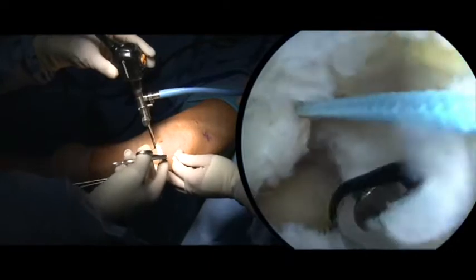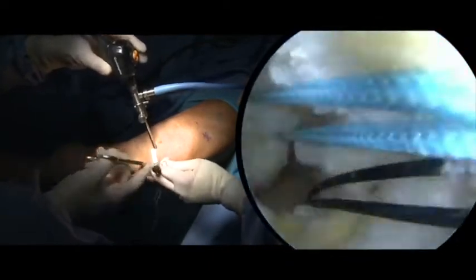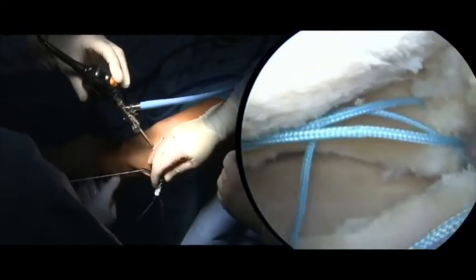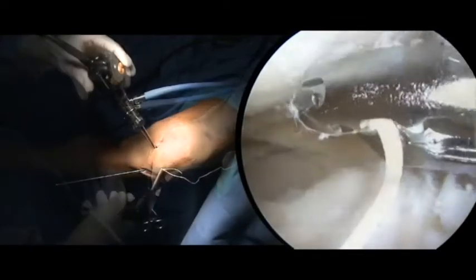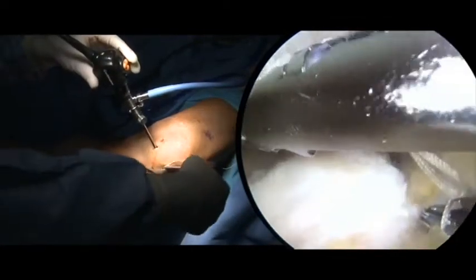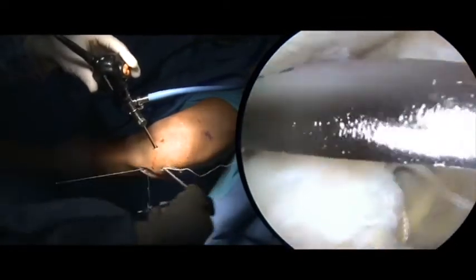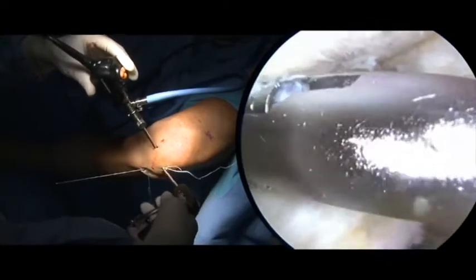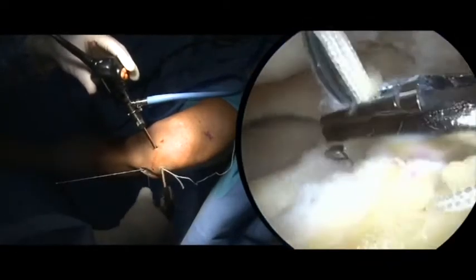A lasso can be used to shuttle each number 2 suture in a criss-cross fashion through the transosseous tunnels. The anteriorly placed sutures are passed through the posterior transtibial tunnel, and the posteriorly placed sutures are passed through the anterior tunnel.